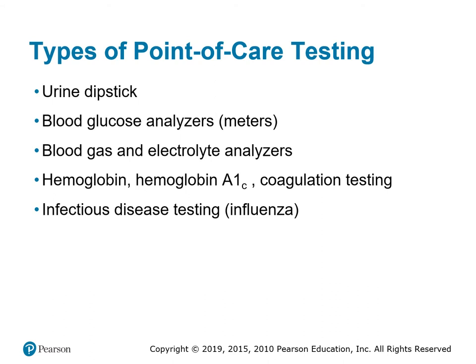Urine dipstick testing. Blood glucose analysis. Analyzers, just the meters, for sure you all have seen those in the lab. Blood gas and electrolyte analyzers, hemoglobin, hemoglobin A1C, coagulation testing, infectious disease testing, for example influenza.